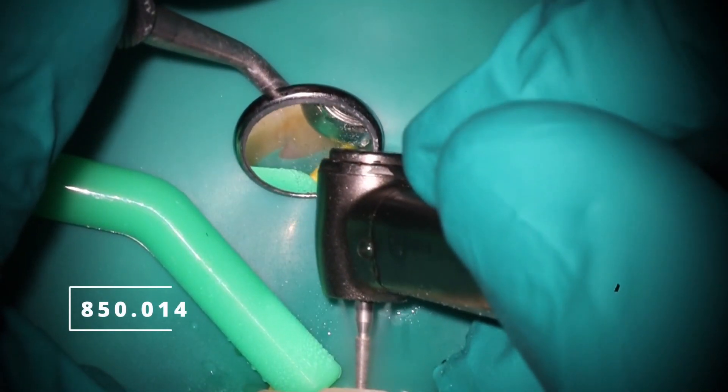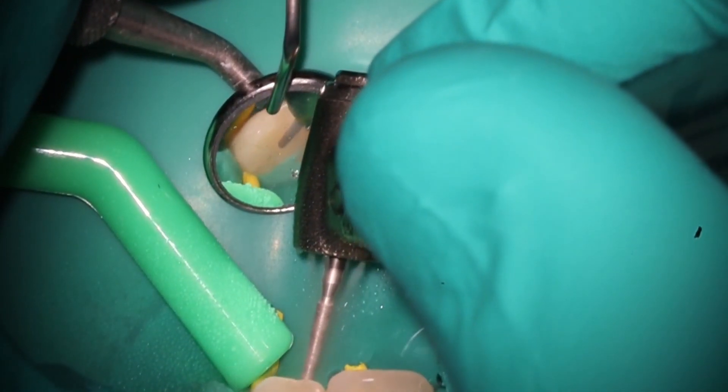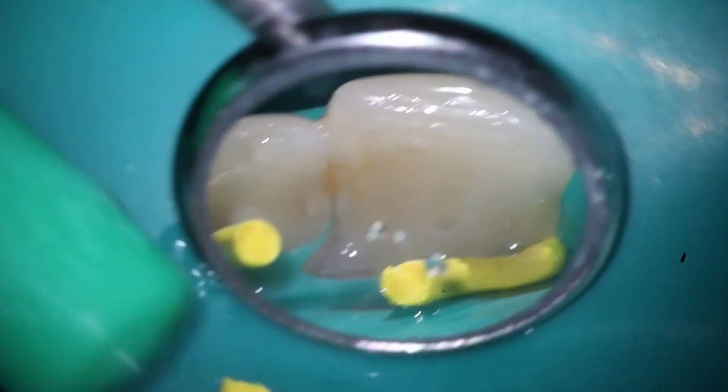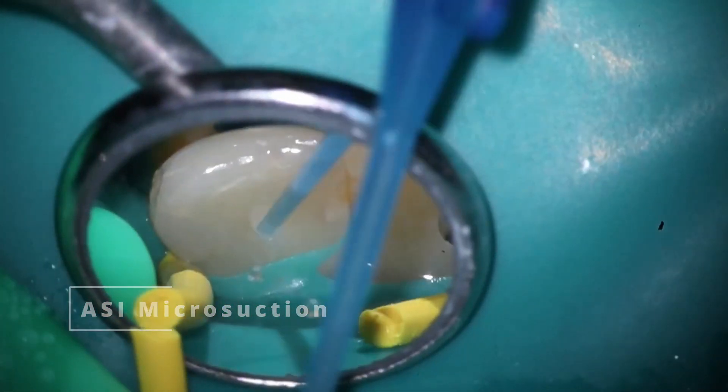As far as your access, really straightforward — just with that workhorse 850, kind of drop right on in. Younger patient here, so the access is going to take very, very little. This isn't sped up. These are some of my favorite ones to access. You can see as soon as we drop in we get that nastiness coming in there. On cases like this where we have a lot of drainage, I like to use the ASI micro suction that's attached to my cart to try to get as much of that out as possible — it's what I call the poor man's Gentle Wave.